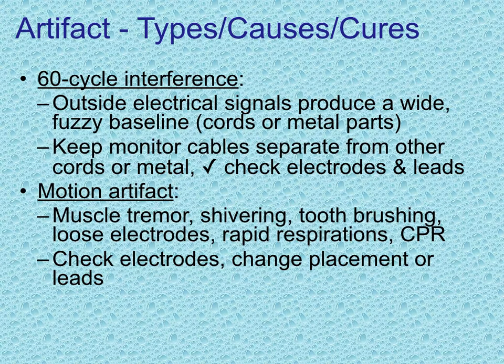There's something called motion artifact. Motion artifact can be from a muscle tremor, shivering, toothbrushing, loose electrodes, respirations, etc. Again, checking the electrodes and checking placement of the leads would be your cure for correcting these problems.